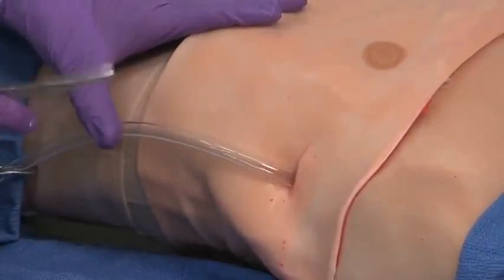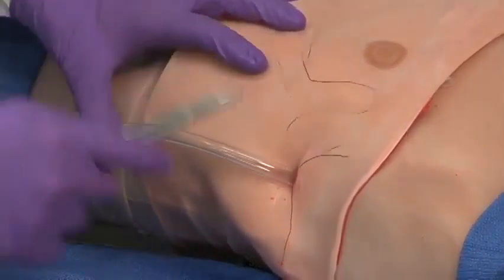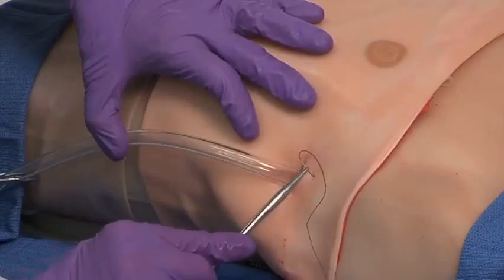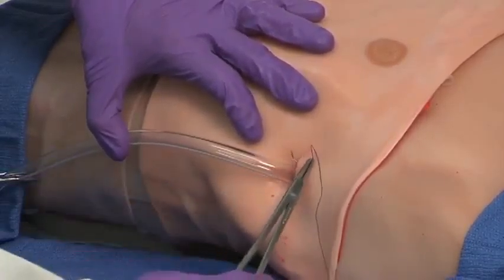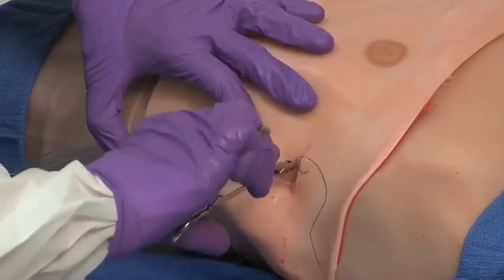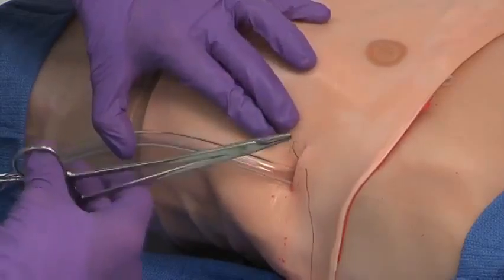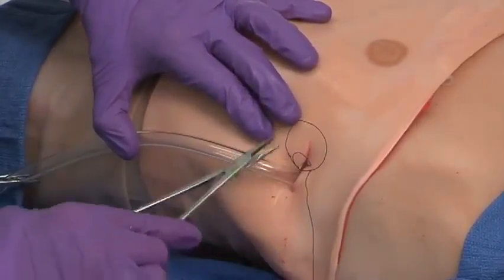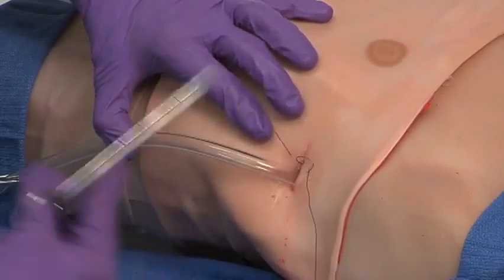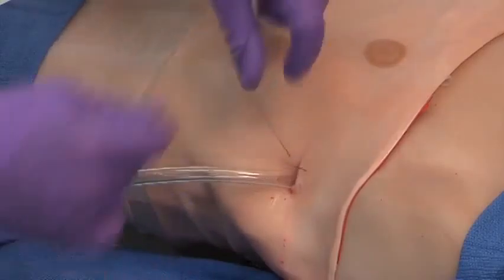Now that the chest tube's in place, we're going to go ahead and sew it in. Generally, you want to use at least an O silk. You're going to create a suture on either side of the incision, taking a nice generous bite. The goal here is to secure this tube in place so it doesn't get pulled out, particularly if this patient is going to be transferred somewhere else. You want to make sure you secure it firmly. So we're going to tie this down.